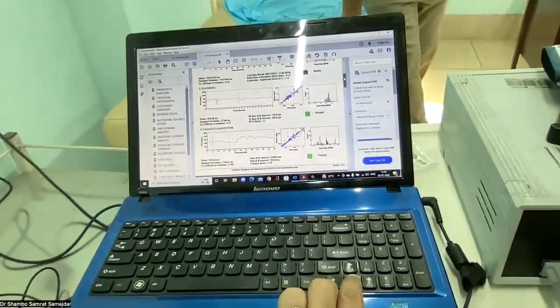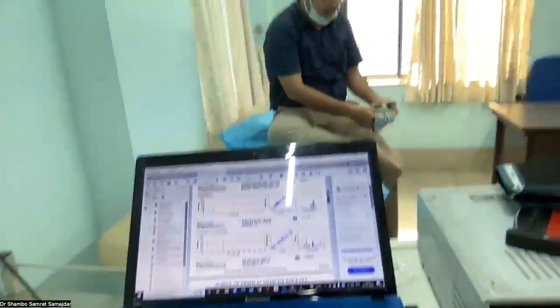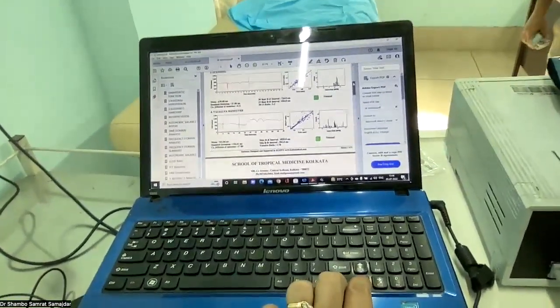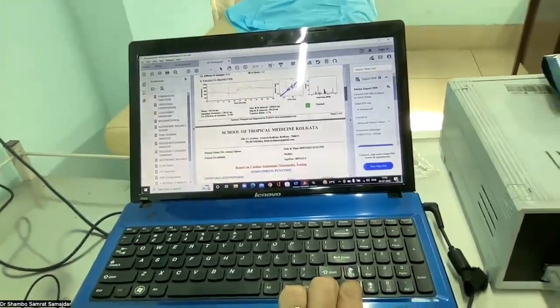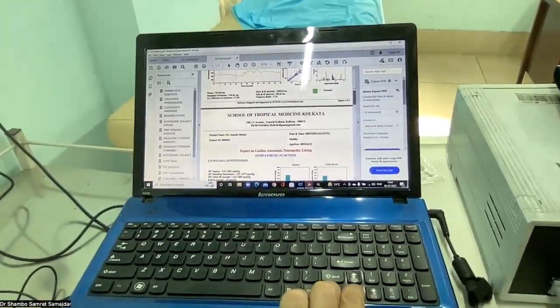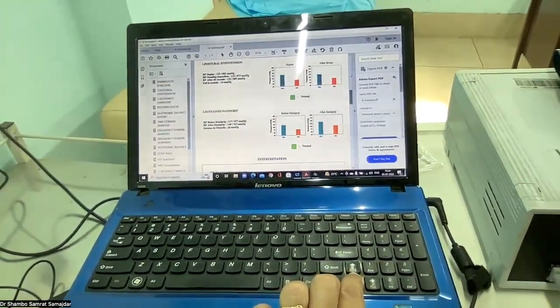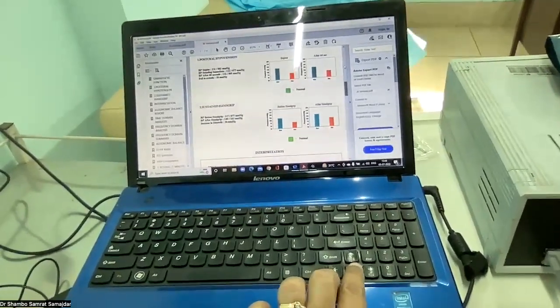That is again normal. Here we can see the standing ratio 30:15, and also we'll find the Valsalva maneuver, the Valsalva ratio, which is 1.74. Again, it is more than 1.2, so that is normal. Now moving to the sympathetic nervous system function testing. Again, the orthostatic hypotension is there or not, that we can find.